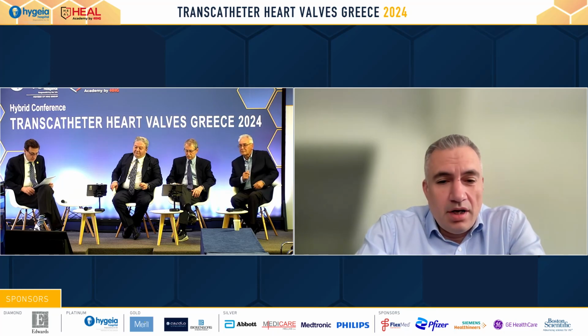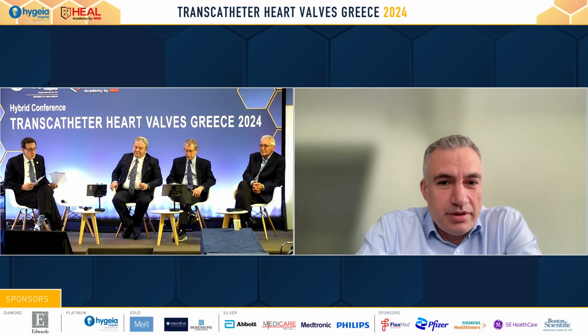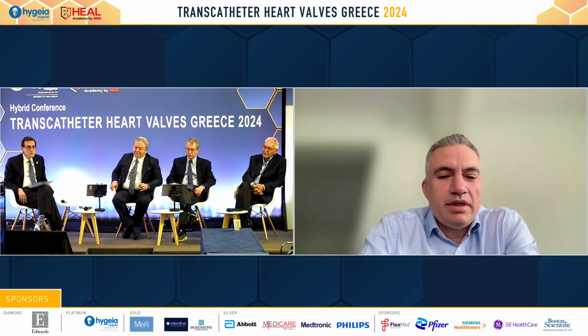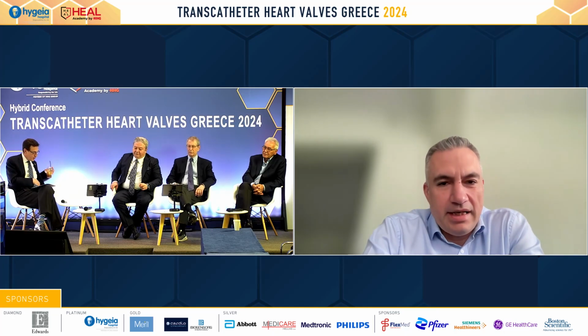Just want to say that deployment is very important even in older patients, because you never know how long they will be around and if they will need a second TAVI at some point. So we have to do our best to follow certain benchmarks and do the best deployment we can in the room. Of course, can we say that we can reproduce deployment 100% every time? No. We all have to work and get better at that. But we have to do our best in any case.